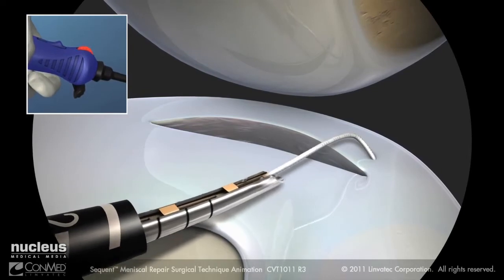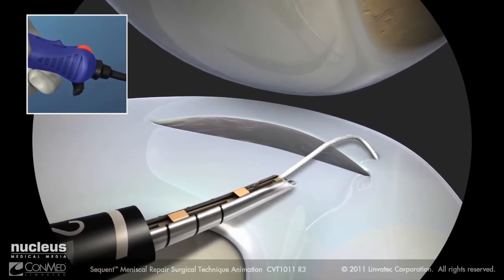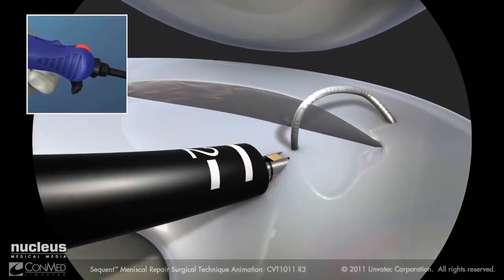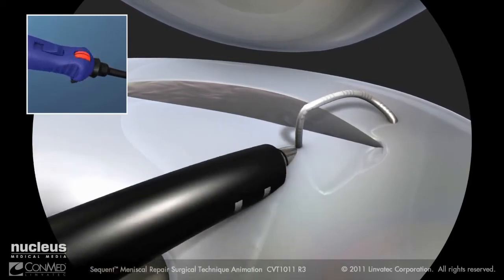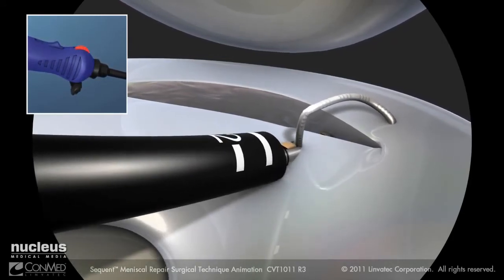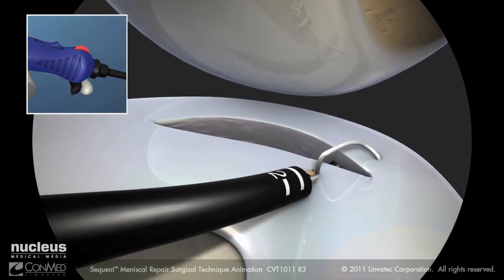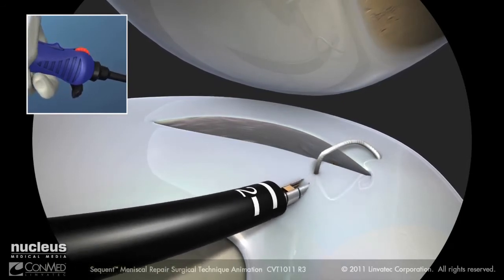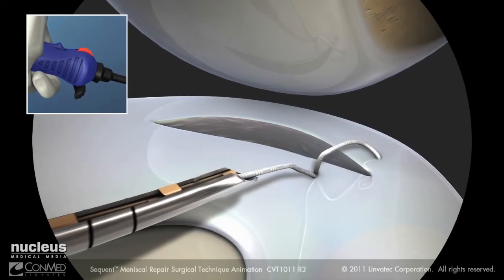Target the position of the next implant on the meniscus. To place the second implant and fix the stitch, again pierce the meniscus. Rotate the device two full revolutions, engaging the knotless fixation. Advance the trigger, and then pull back and release to deploy the next implant. Withdraw the needle from the meniscus.